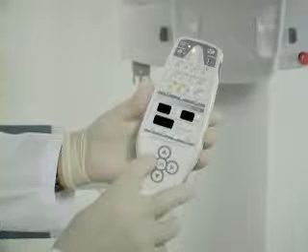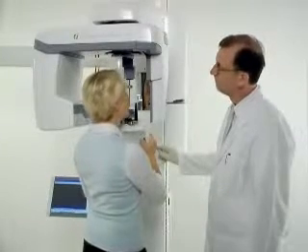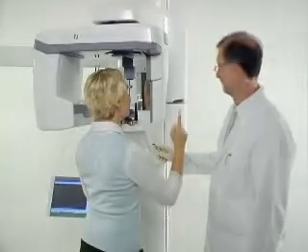This step requires the patient to be steady during the imaging procedure. The height of the unit needs to be carefully adjusted for the patient's comfort and stability. Fine tune the height of the unit so that the bite index is not bent from its natural angle. Ask the patient to hold their hands on the handles. Make the exposure. Hold the exposure button pressed throughout the projection image series.